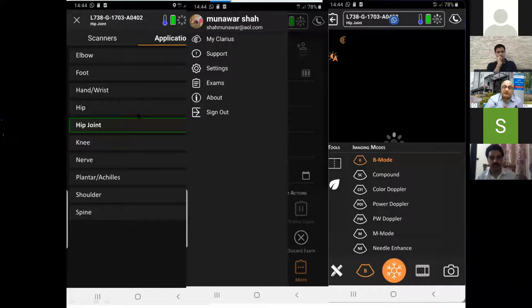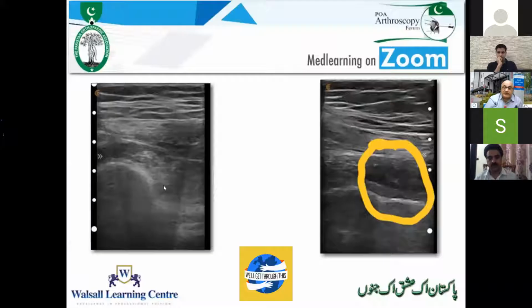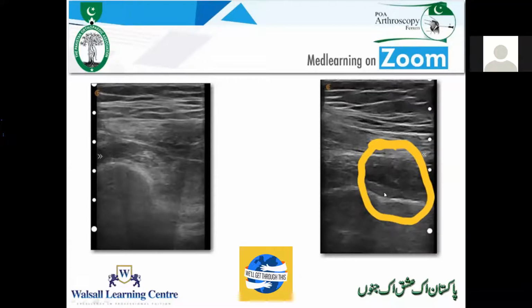Okay, the ultrasound does everything and also does needle enhancement, so it shows me what I want to do. This is my first hip injection, which I don't usually do. I only do shoulders. But unfortunately, when you do an injection clinic, this is what you do. So this is the neck and head. This is the capsule. If you're very clever, you can see the needle coming down there into the capsule to inject directly into your hip joint.